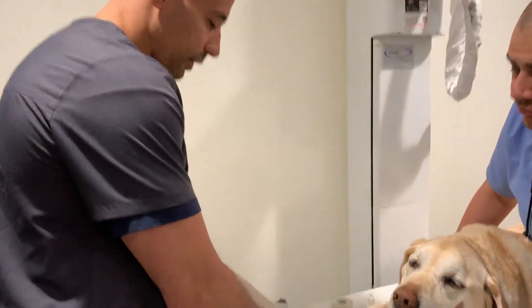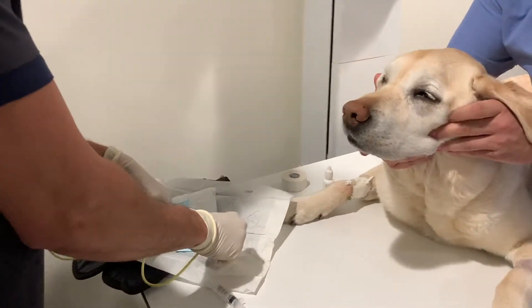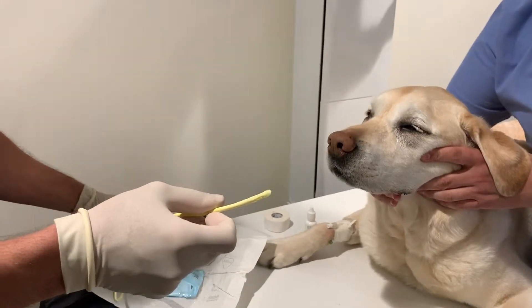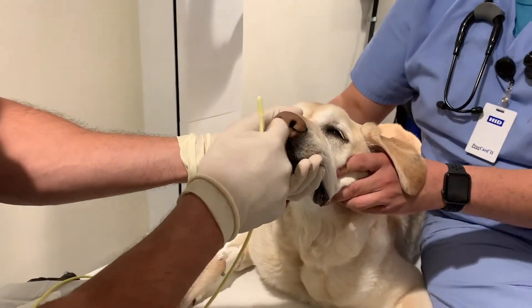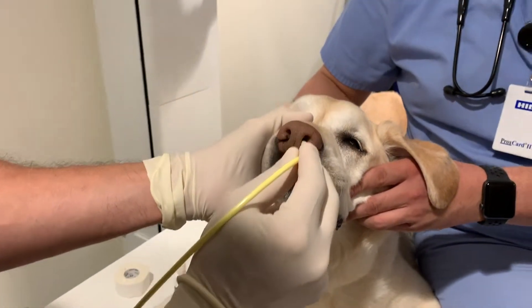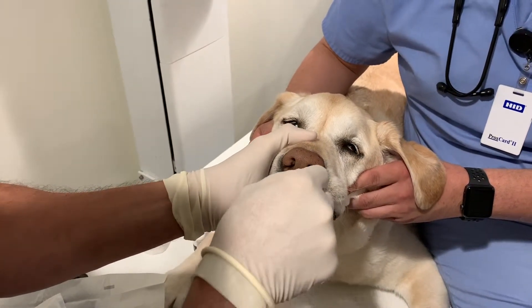We're then going to place the nasogastric tube in some lube — that way it'll help move things along once we go into the nose. It doesn't matter which nostril you pick. I like the left nostril because the esophagus tends to lean more towards the left as it enters the stomach, but it doesn't really make a difference. When you look at the dog's nose, they have this curly opening to it. So you want to go ventromedially — to the bottom of the nostril and towards the wall on the inside. That'll help run it nice and smooth through the nasal cavity.